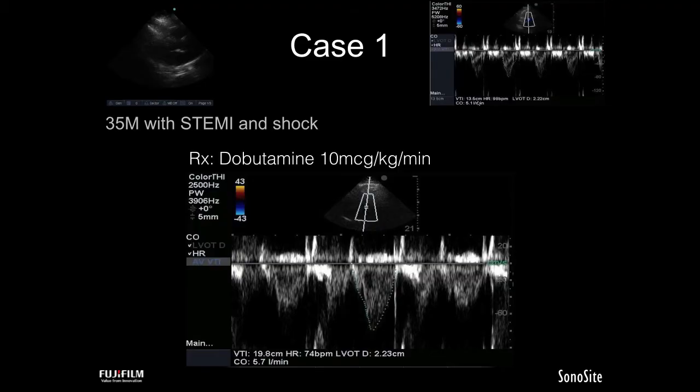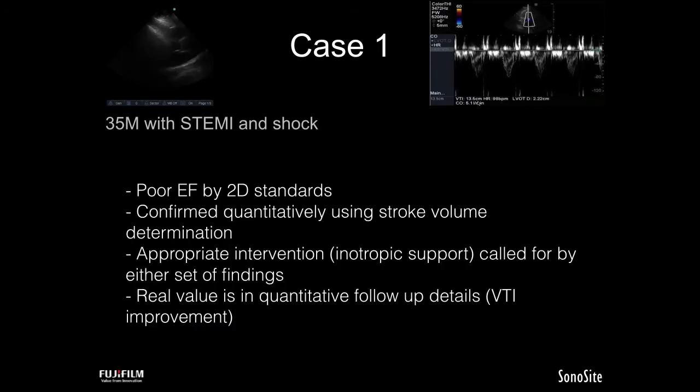We know that we can likely reach resuscitative targets. We can call off the balloon pump. We can concentrate then on the ventilation side of things. We can consider diuresis because we've now achieved renal perfusion, presumably with regained stroke volume. So everything looks a bit different. And this was only obtained about 35 minutes after the initiation of the dobutamine. So we immediately have this gratification. And so it's a really rewarding case to follow up that dobutamine initiation.